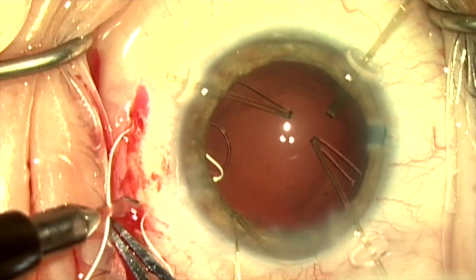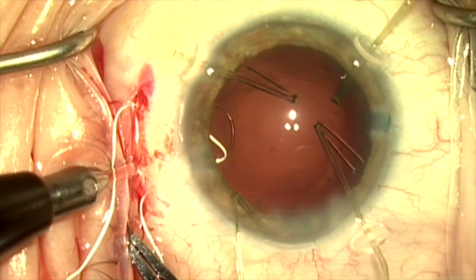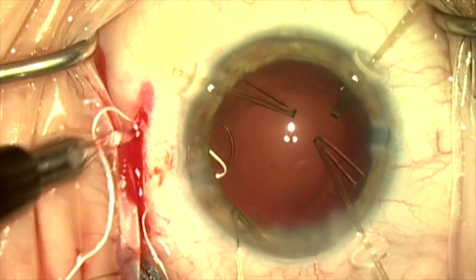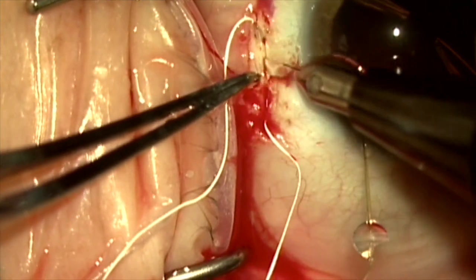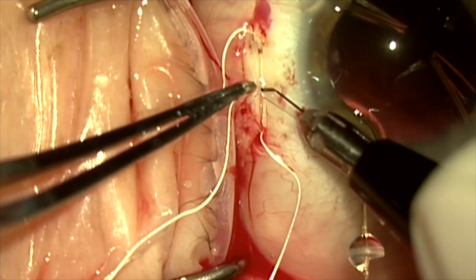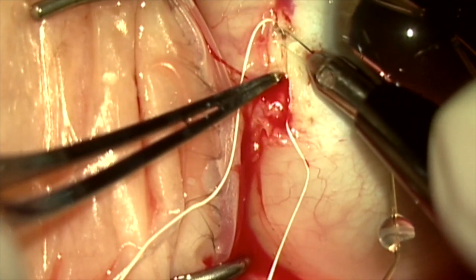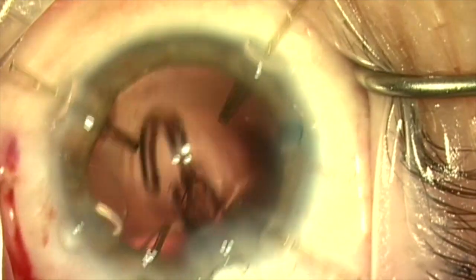I'll now connect these two sclerotomies with a scleral groove using a diamond blade. One modification I've been doing for the past few months is to create a shelf in the scleral groove — a little shelf so I can tuck the Gore-Tex suture under it when I've tied it.